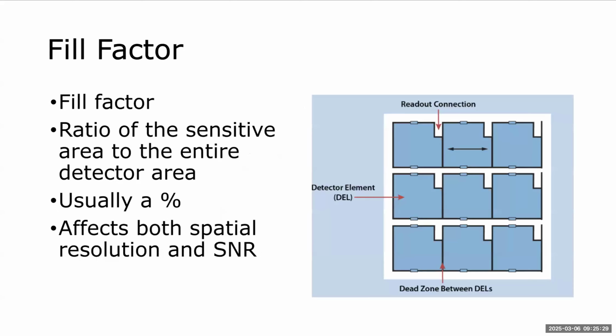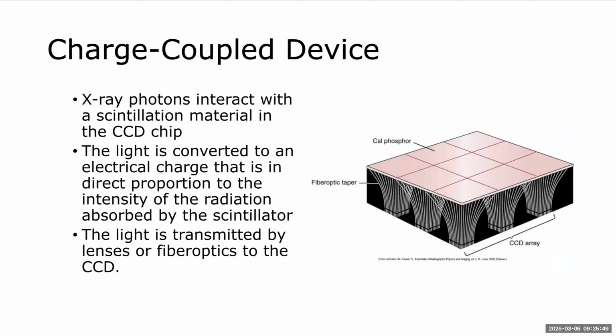So let's look at fill factor here. Fill factor is the ratio of the sensitive area to the entire detector area, so the area that's actually going to be interacting with the photons. It does affect both spatial resolution and signal to noise ratio.